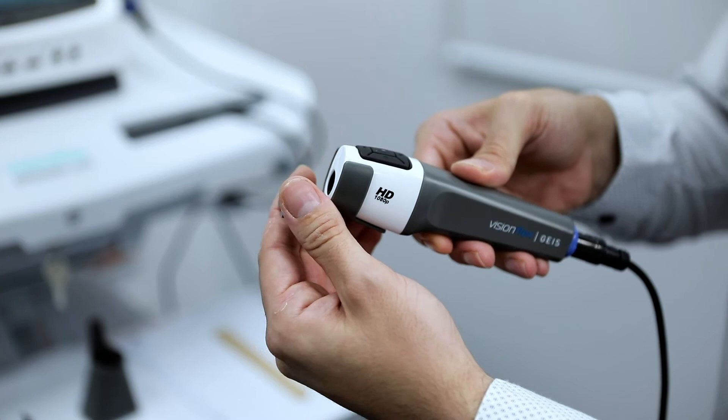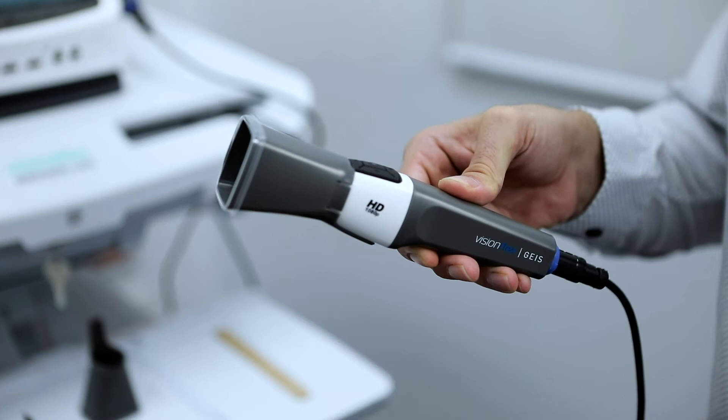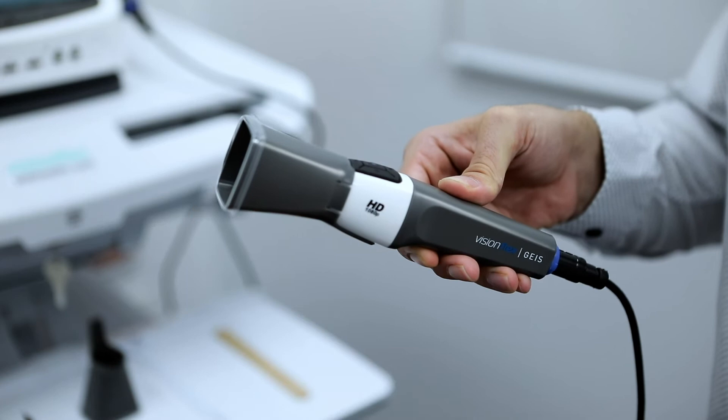The final attachment is the dermatology hood. Remove the grey attachment and replace it with the hood — it should neatly clip into place. You can then place the hood against the skin for clear close-up images with consistent lighting.